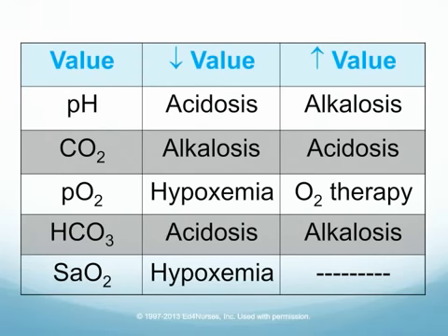This is interesting, isn't it? When you take a look at these values right here, you'll notice that the CO2 goes the opposite direction of the pH. This is why we don't want to talk about values being high or low, but we want to make the interpretation of the value instead.